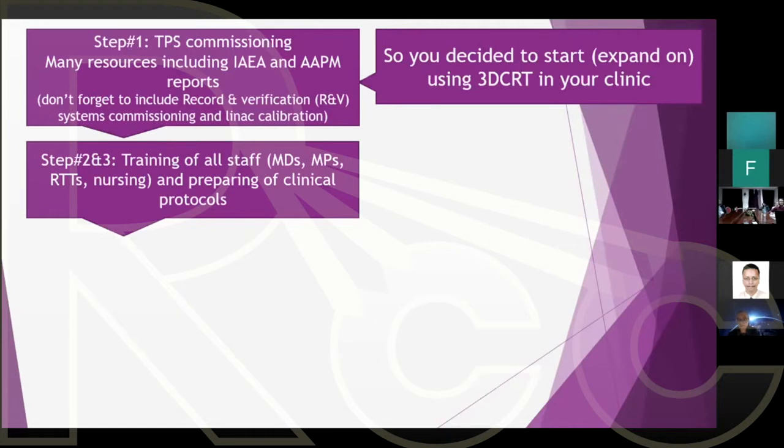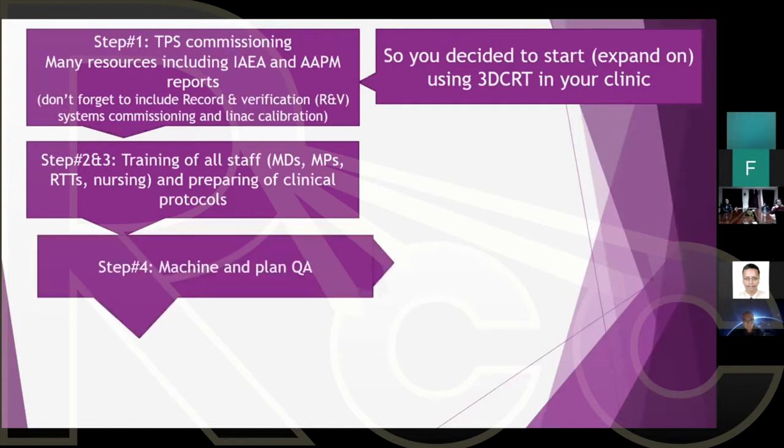So you cannot have a protocol from one clinic to apply to the other clinic. You have to make your own protocol based upon your own practice. What would you accept in your case? And then make sure that whoever is doing breast planning and breast simulation in your clinic, they're all following the same protocol. When you have things written down, documented, and everyone is doing the same thing, you have less room for error. And with 3D CRT, the level of error becomes much more than when we're doing 2D planning. So you really want to make sure things are uniform and homogeneous.